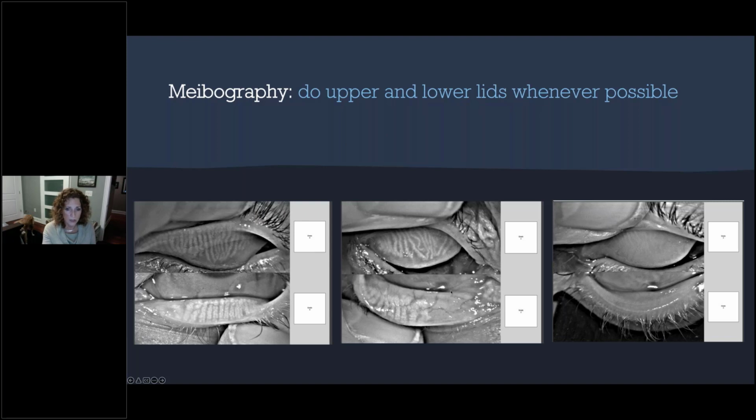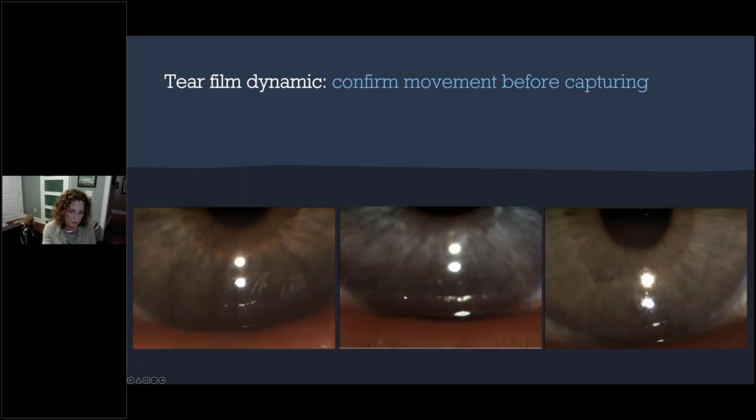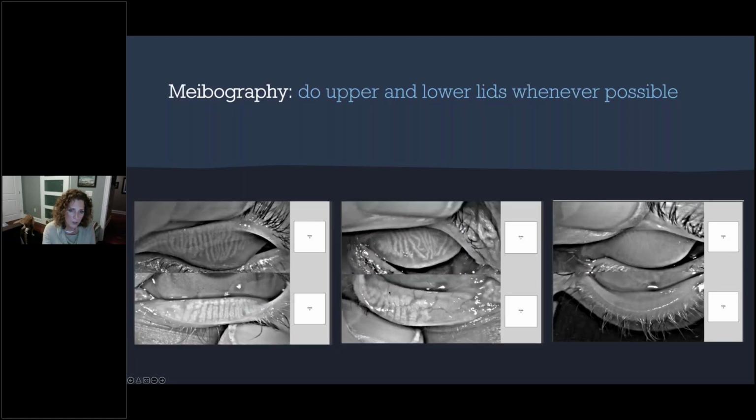This one, pretty good. Here we've got loss nasally, and you can see anywhere there's black lines. So even right here where my arrow is and these vertical lines in the middle of the glands, anywhere there's black, that's blockage. A lot of times I'll see horizontal blockage here, and then you'll see just basically where we lose that cylindrical shape. Sorry about that. We lose the cylindrical shape after the blockage. So just like in these, we kind of lose definition. You're not sure where the gland is.